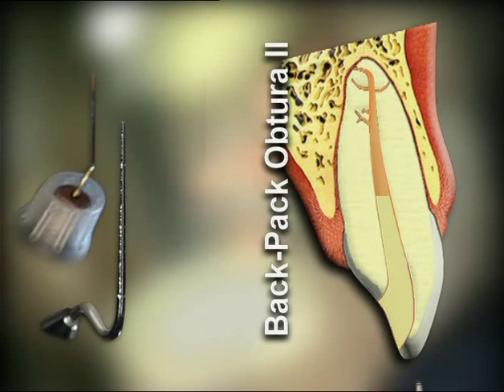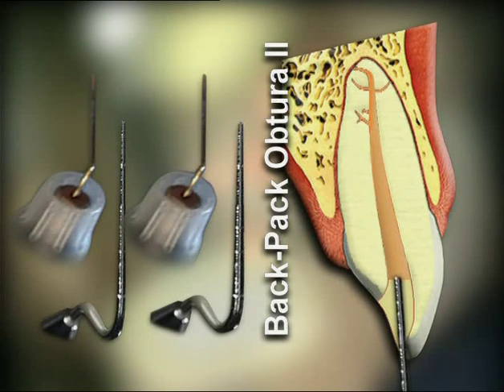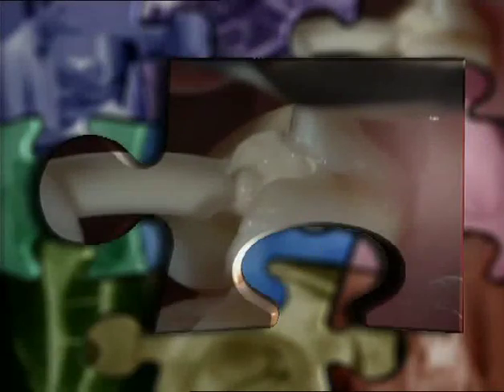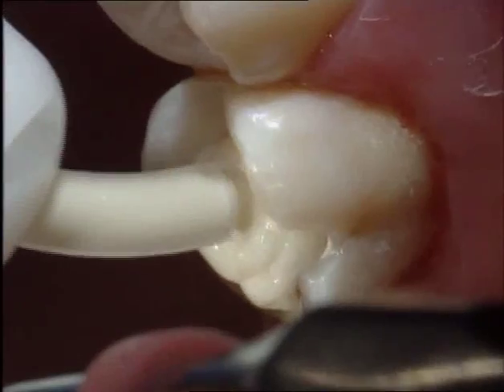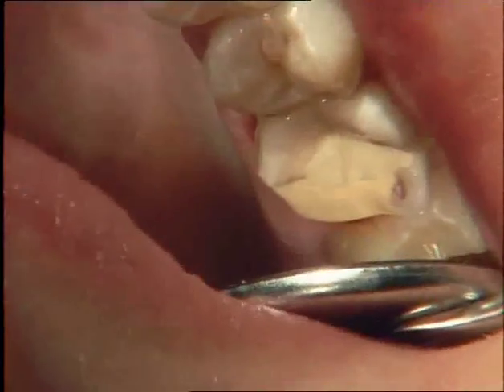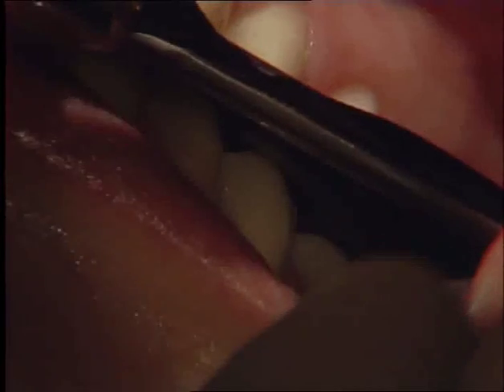The hot tip of the needle will resoften the most coronal aspect of the apical core of gutta-percha, ensuring cohesion and homogeneity during backpacking procedures. Ideally, the tooth is built up immediately following the endodontic treatment by means of a bonded composite restoration, if enough tooth structure is left. In this way, it is ideally prepared for further restorative procedures.